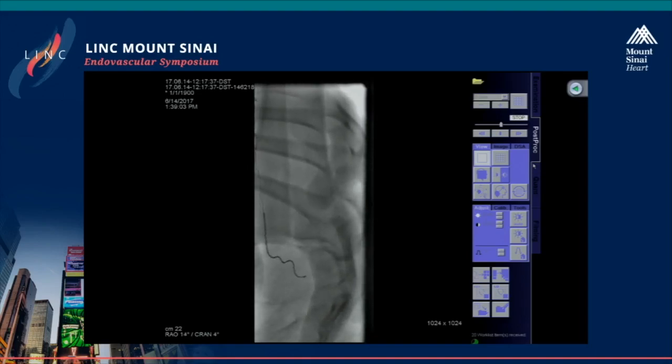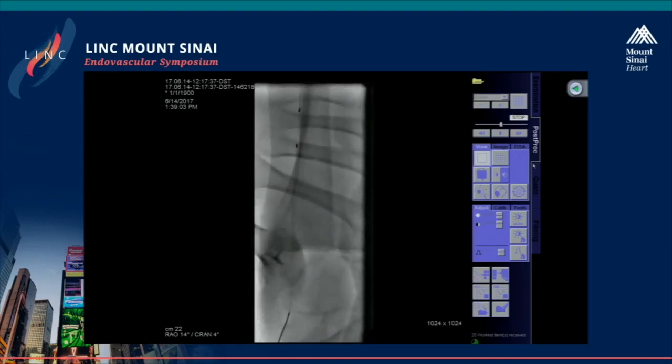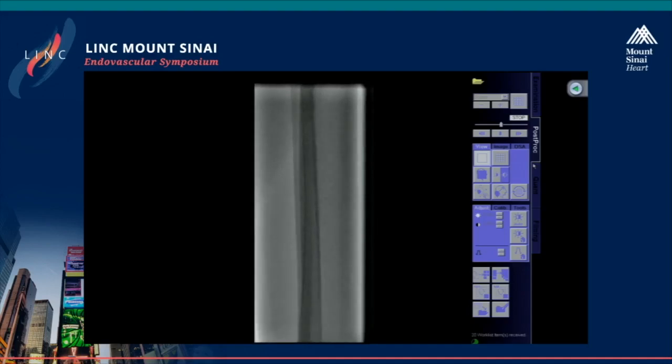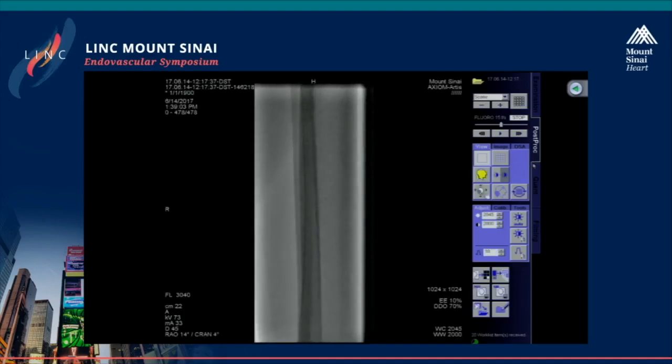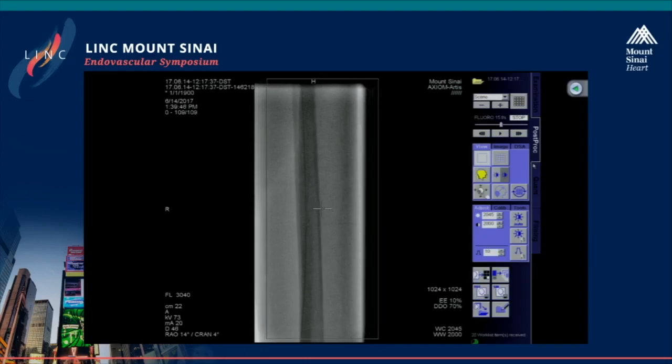Probably. I mean, it's dexamethasone. At the end of the day, this type of lesion would be the almost typical study case we are looking for, let's say, for the Lutonix below the knee trial, for instance, or for the LIMBO bullfrog project. So I think it's a typical lesion where we currently don't know finally what is the solution, but I think we have several options which are currently under investigation. Marian, I would have classified this patient for.